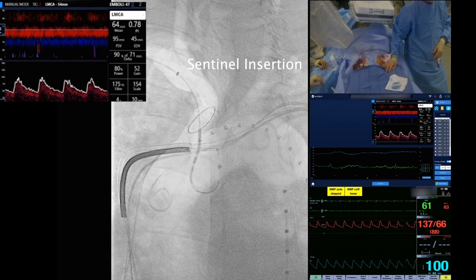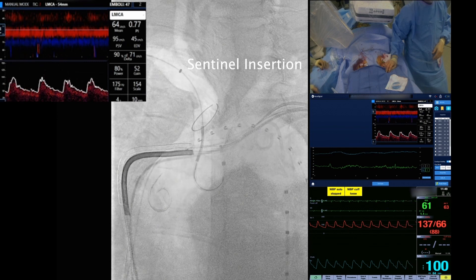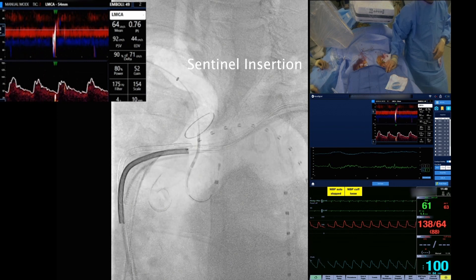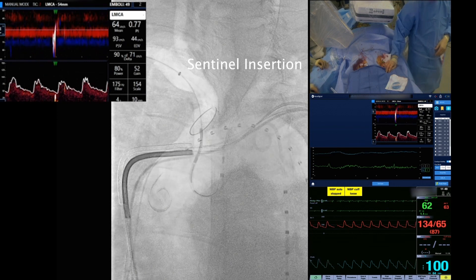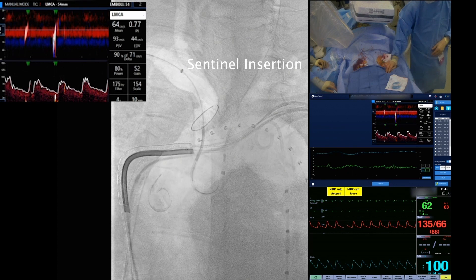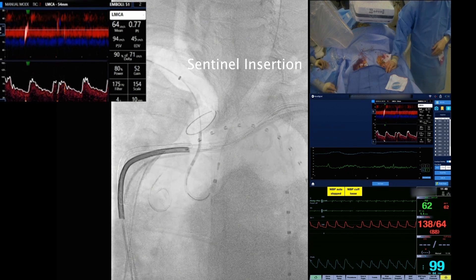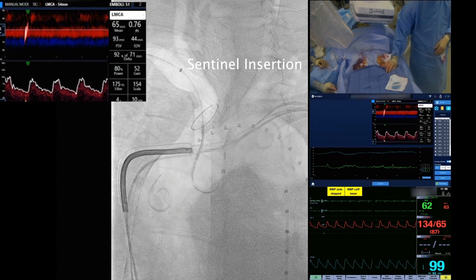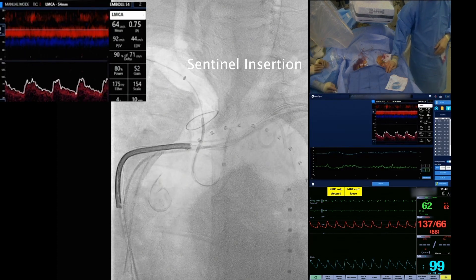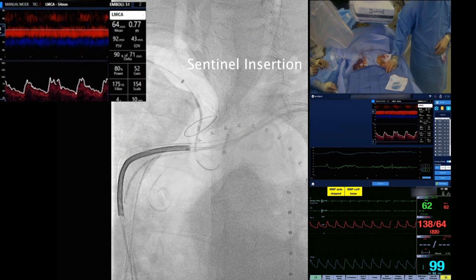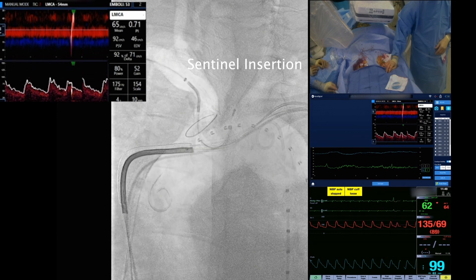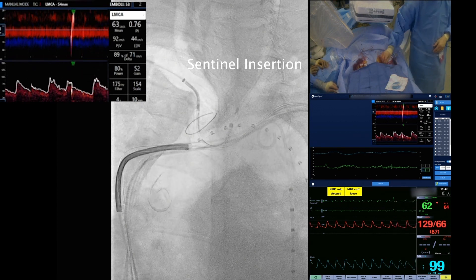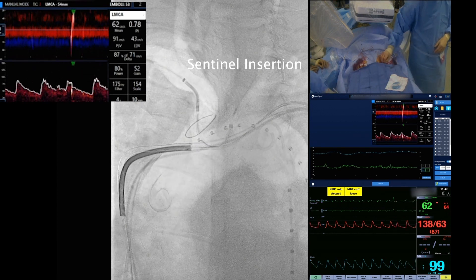Here we see multiple attempts to wire the left common carotid. After successfully advancing the guidewire into that vessel, the entire device system is pulled back so the catheter cannulates the left common carotid ostium.